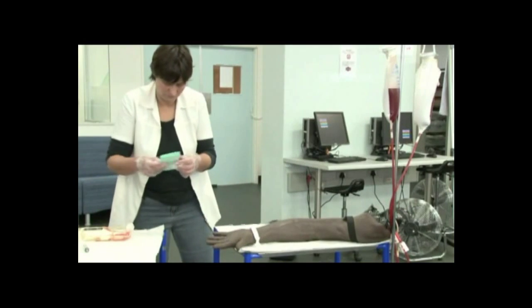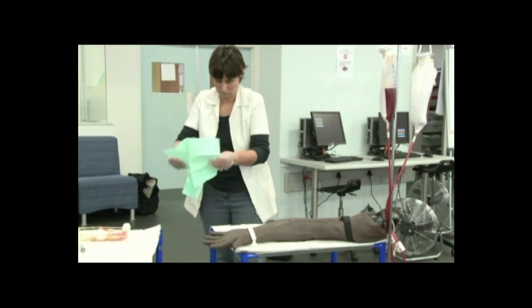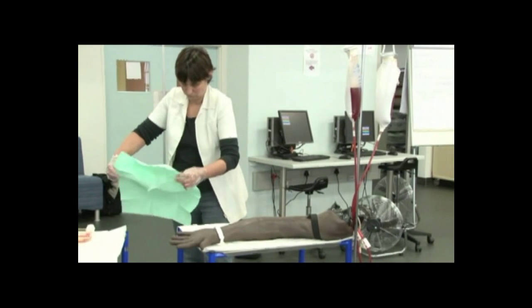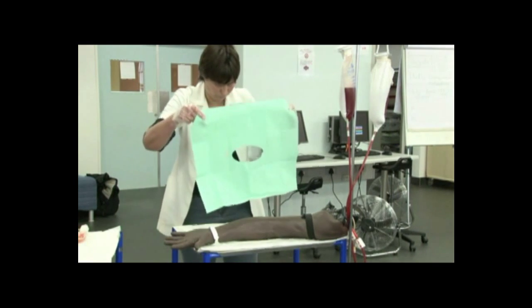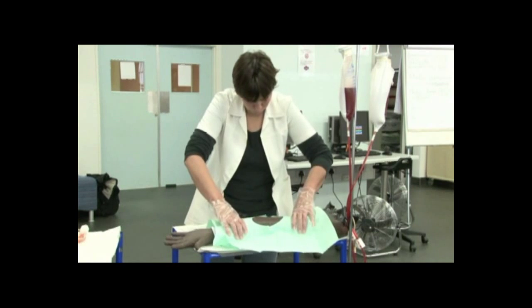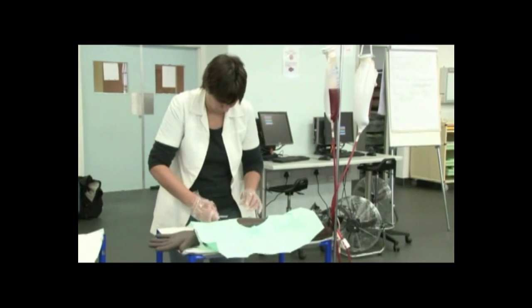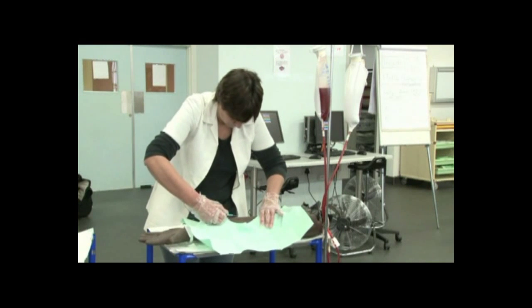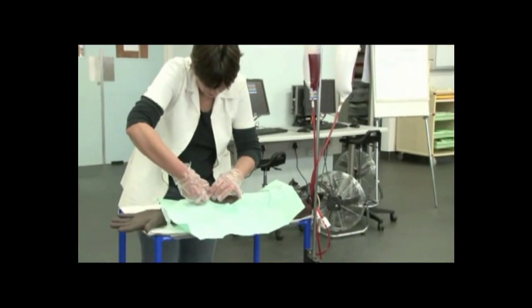Place the green sterile cover with the opening over the site for the blood culture. Make sure that when you apply the sheet that you do not make contact with the skin. Insert the needle into the pre-selected vein and collect a minimum of 10 mL of blood. This is in adults. If using the vacutainer system, the blood culture must be the first specimen to be collected.